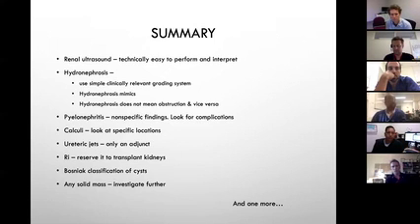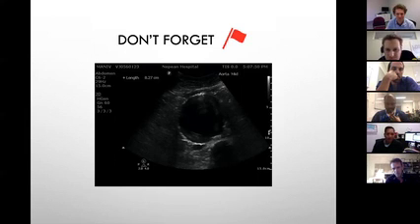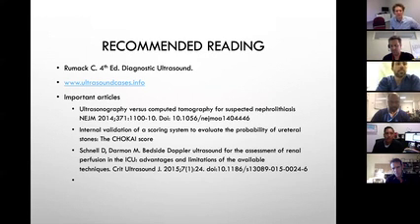All right, and one more. Did I put the one more in there? Yeah. This is ED brain. Anyone who comes in with renal pathology, try to look at the aorta for an AAA or something. Remember those red flags for flank pain. One of them is abdominal aortic aneurysm. So keep that in clinical context here. All right, that's about it, I think, guys. From my end, I've got some reading material.